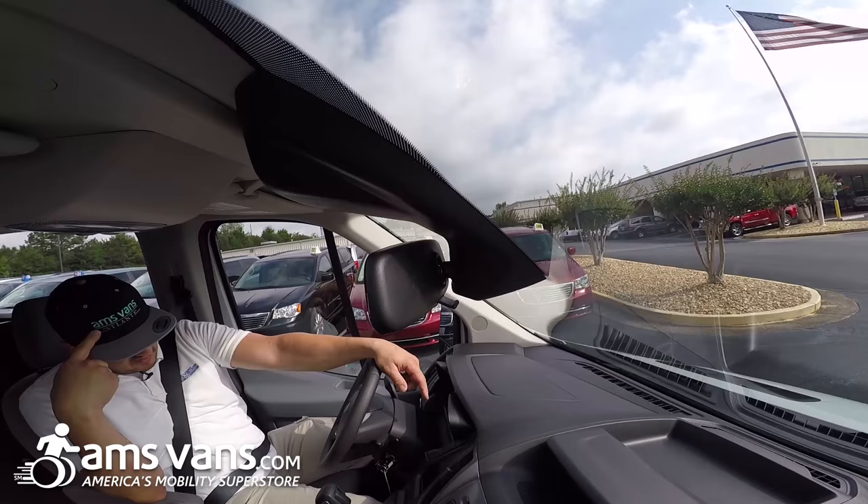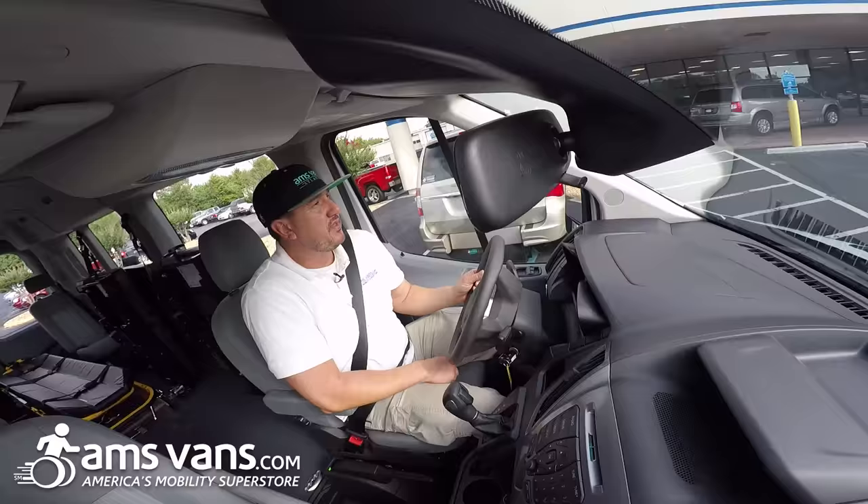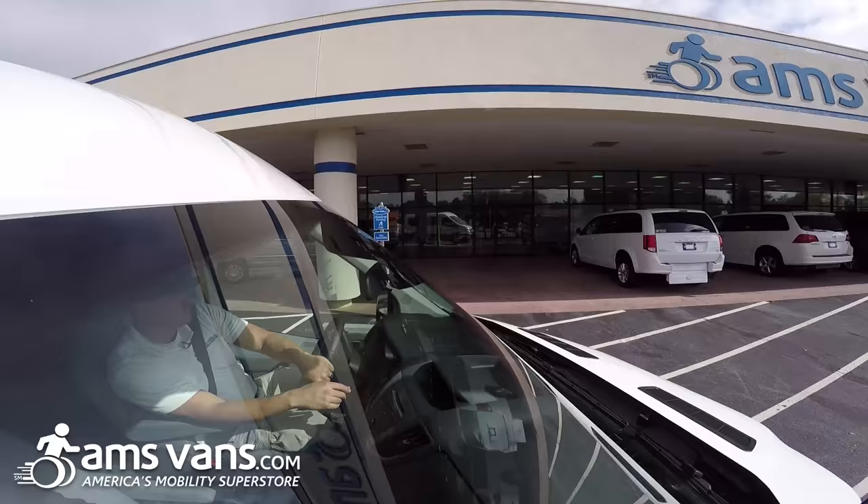Welcome back to AMS Vans, America's Mobility Superstore. Today we're going to go over this 2016 Ford Transit 3500 series van. We have a side lift application with a non-emergency medical transport application. Come on inside and we'll show you how it's done.